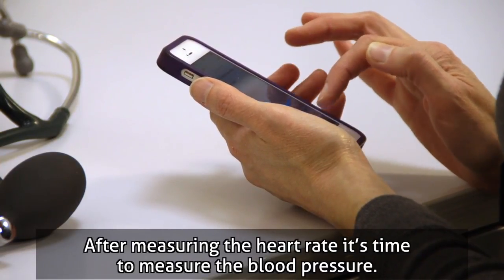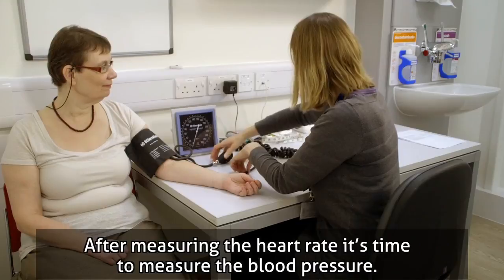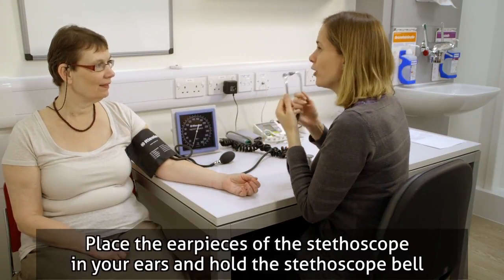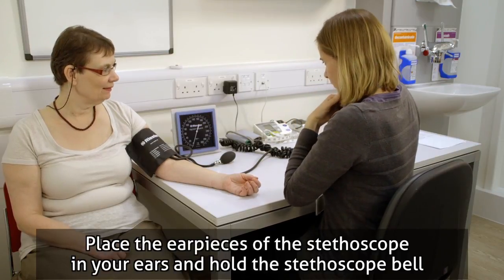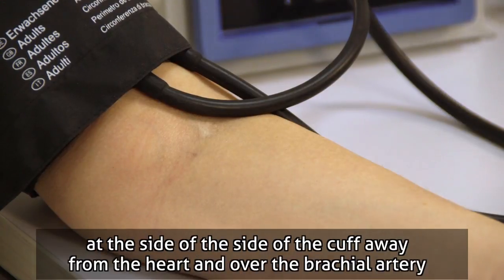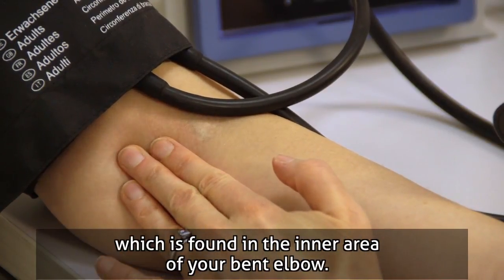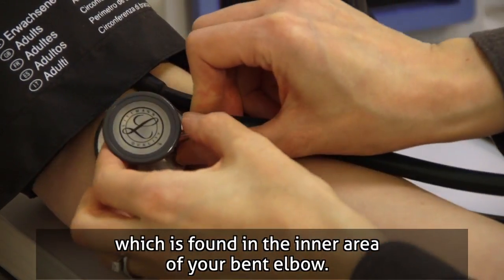After measuring the heart rate, it's time to measure the blood pressure. For best results, don't talk during the measurement. Place the ear pieces of the stethoscope in your ears and hold the stethoscope bell at the side of the cuff away from the heart and over the brachial artery, which is found in the inner area of your bent elbow.